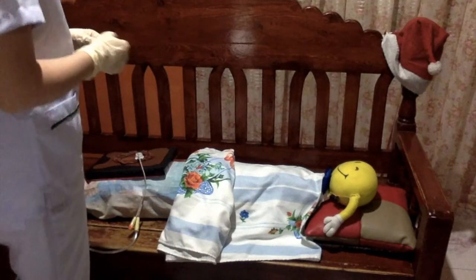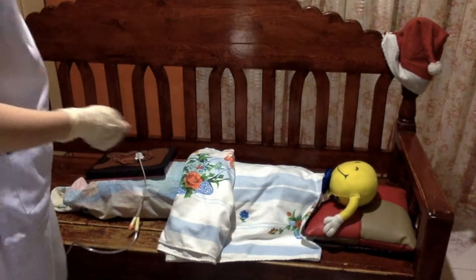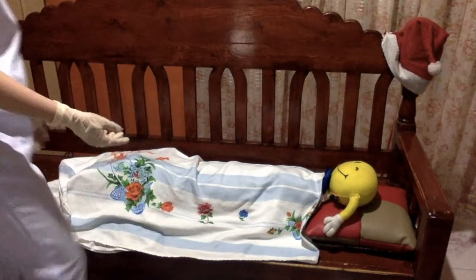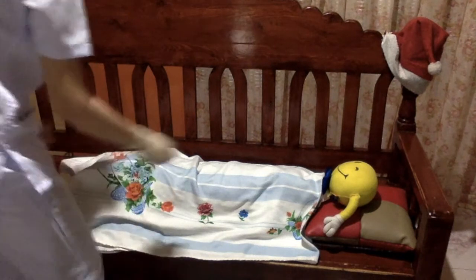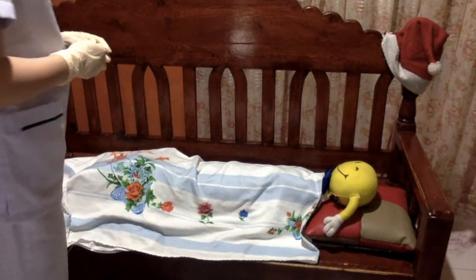Miss Miley, tapos na po tayo. Kamusta po pakiramdam nyo? Baba lang po natin yung legs nyo ha. Buti naman po at okay lang po kayo. Comfortable naman na po ba kayo? Gusto nyo po ba iangat yung banda sa ulo nyo? Hindi na po. Taas ko lang din po yung side rails nyo para po sa safety nyo. Kung may kailangan po kayo, pindutin nyo lang po yung call bell nyo. Salamat po! Then gather and discard or restore all additional equipment to promote a clean environment. Remove and discard the gloves in the proper receptacle and perform hand hygiene to reduce microorganism transfer.